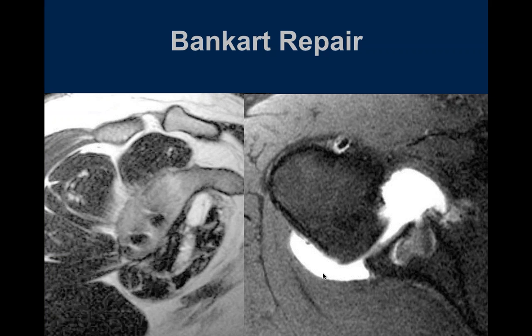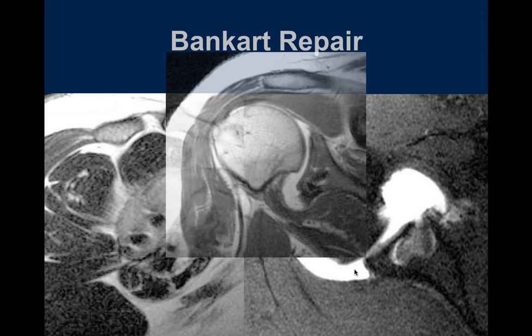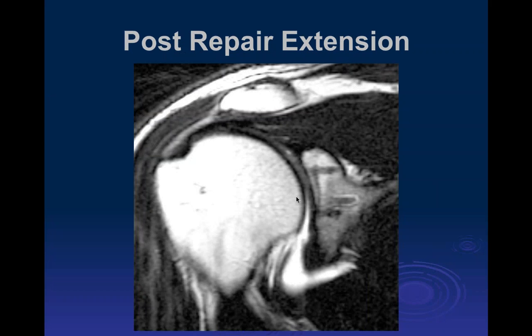And we can see there's kind of a large capacity to the joint space here. There's a reason why there's an MRI of this repair. It would seem that there is a problem with the shoulder. Yeah. Clinically. Yeah. Here we can see the articular cartilage, but this is probably a displaced labrum down here. No, that's what I was thinking.